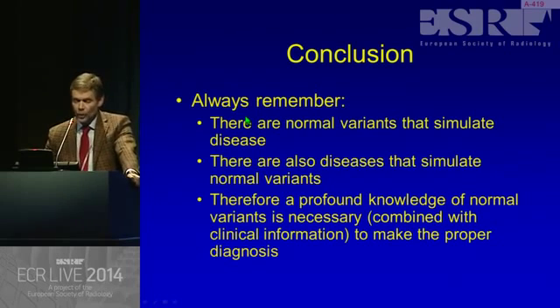So to conclude, always remember, and I haven't shown them all, there are normal variants that may simulate disease, but there are also diseases that simulate normal variants, and therefore a profound knowledge of normal variants is necessary, combined with clinical information, to make the proper diagnosis.